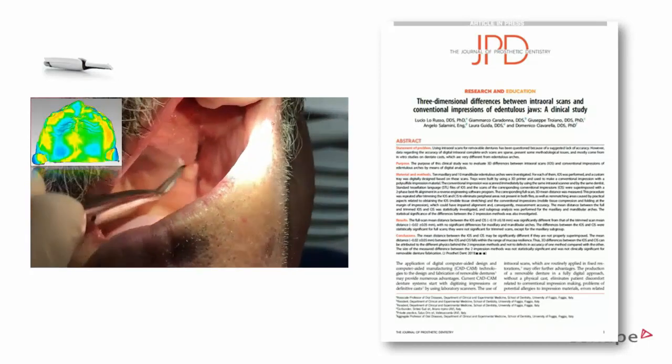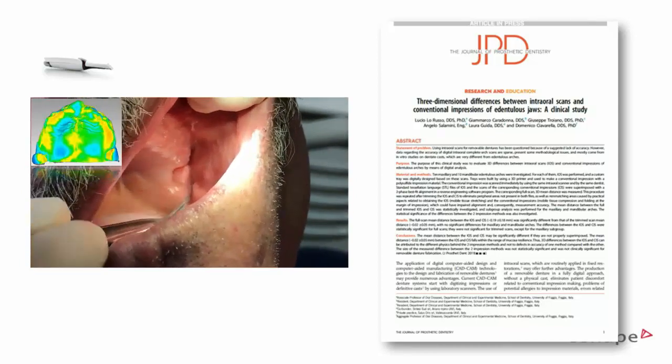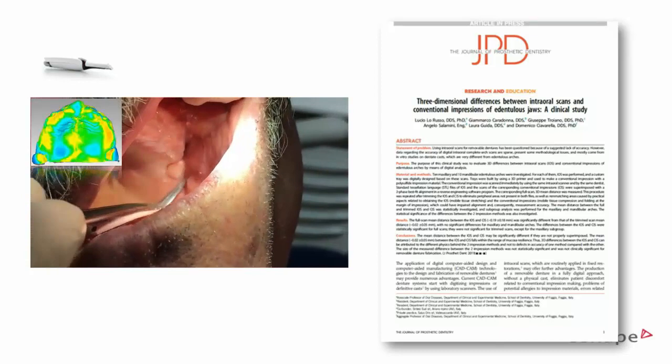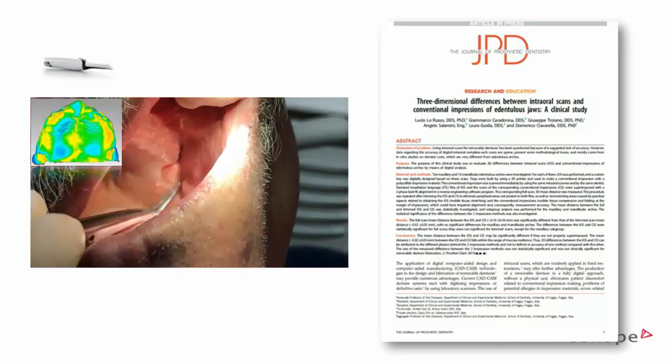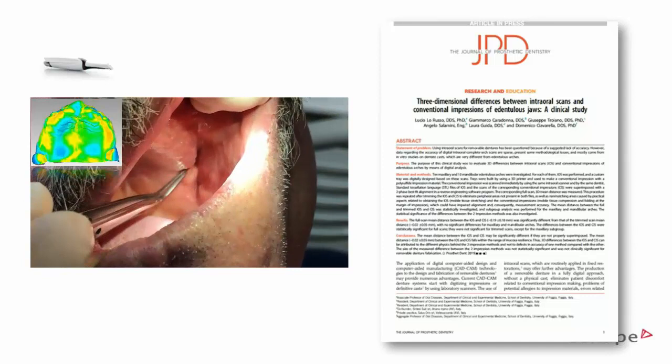There's a question: is scanning the wax rim in the mouth okay? But the 3D alignments are complicated, and we totally agree with that. Yeah, and we are building better alignment workflows. We are building all the different workflows for enabling intraoral scanners as we speak. We'll also see later on the copy denture that we already have good workflows, and the same with immediate dentures as well.